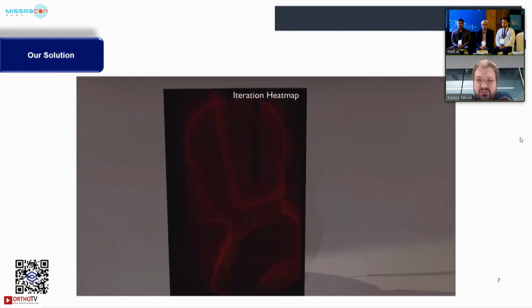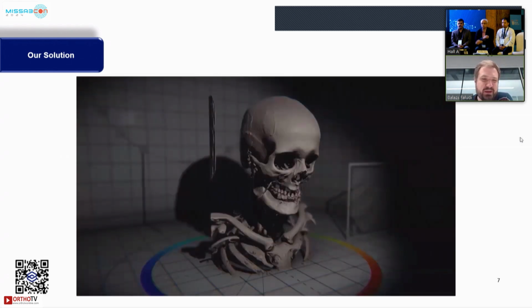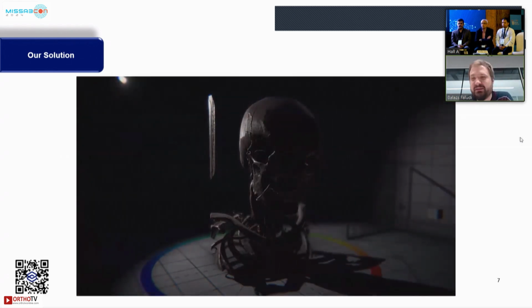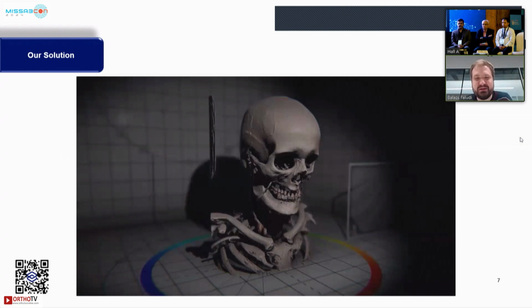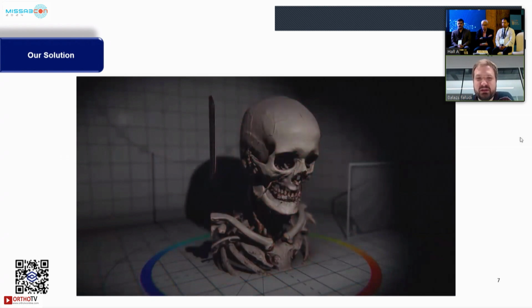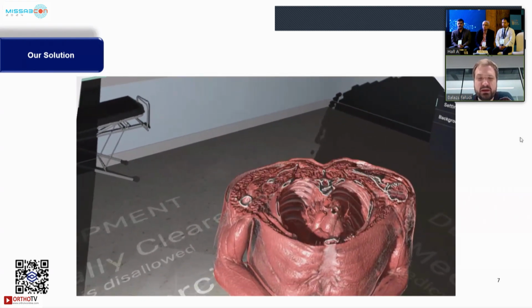This needs a lot of graphics optimizations to run smooth enough, because you need to be able to display these images fast enough to avoid motion sickness. Otherwise, you put on the headset and it stutters, and after 5 minutes, you have had enough. So we spent a lot of effort to try to make it as fast as possible. So this is all happening in real time in a VR headset.